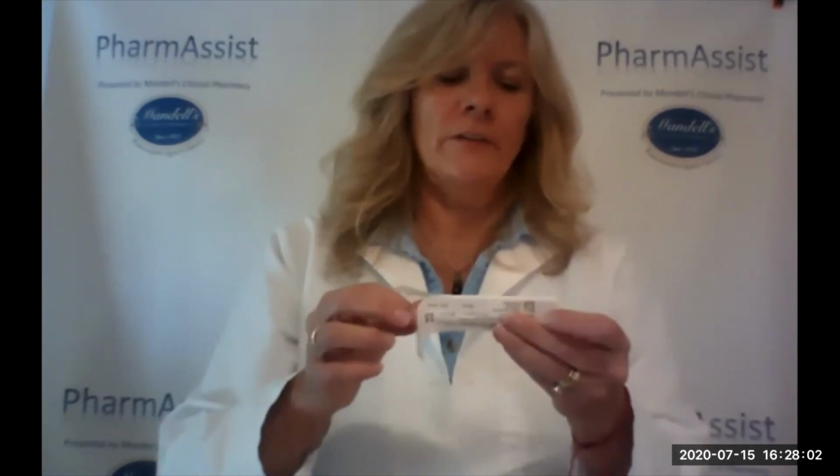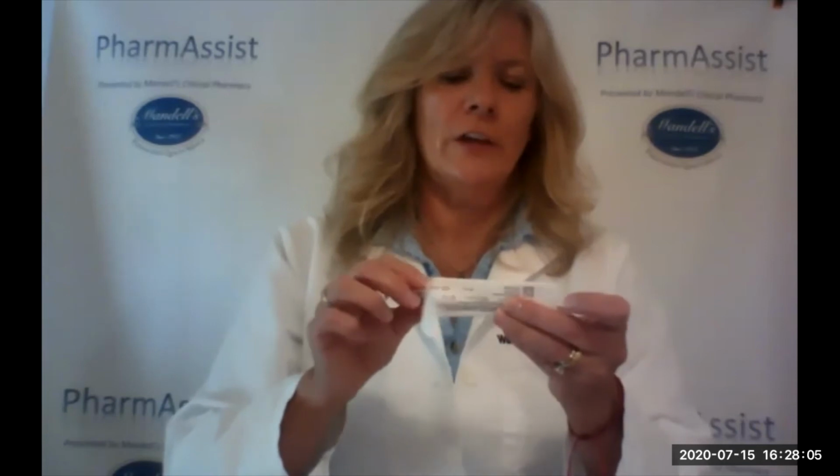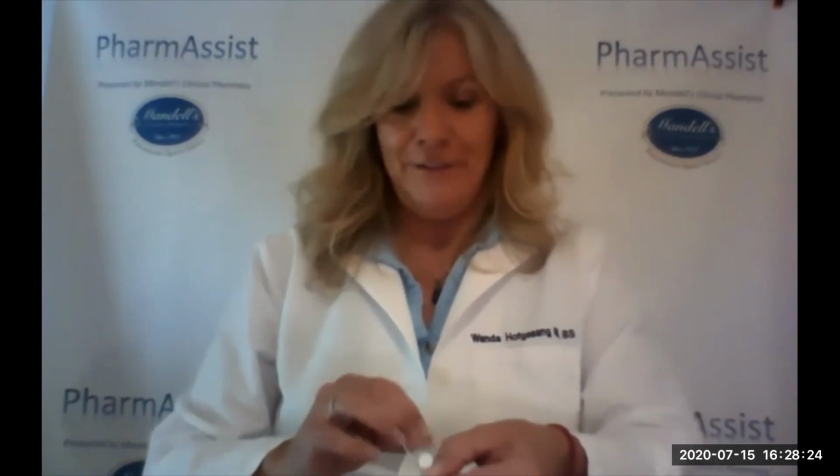And with live TV, I've just actually bent the needle a little bit, so I'm going to actually put that down. See, even for me, things like that happen. And that's perfectly okay. I could feel myself bending that needle because it's very fine. So if that ever happens, I'm going to put that in the sharps container, but let me try again. See, it doesn't matter. Even you can have that happen, but even I can have it happen, so don't worry. So I'm taking out a brand new needle and syringe.